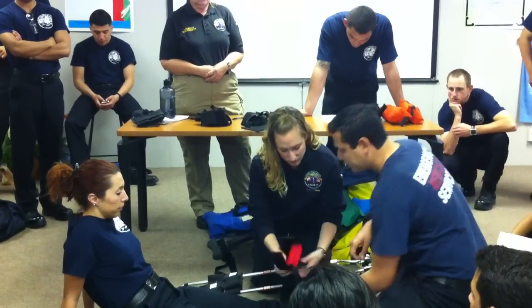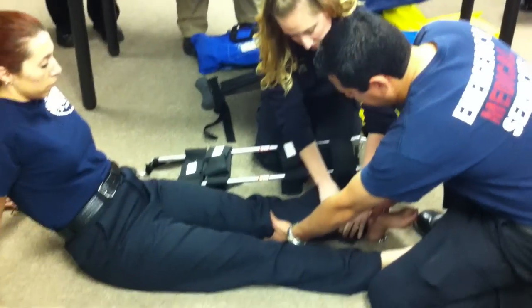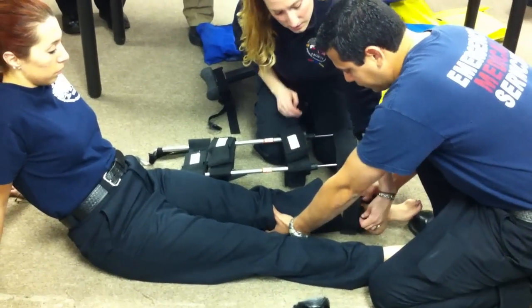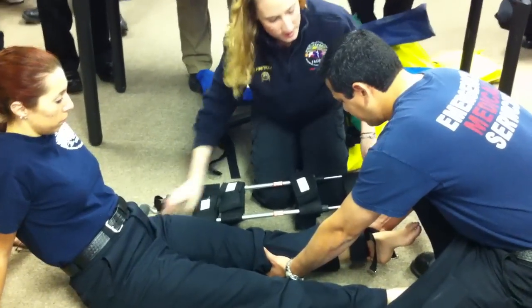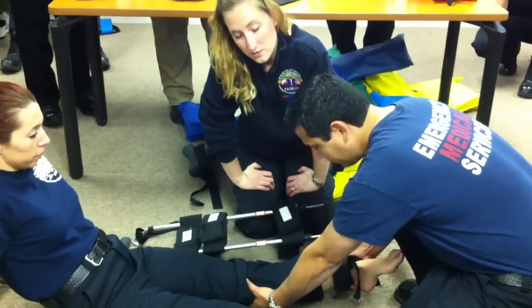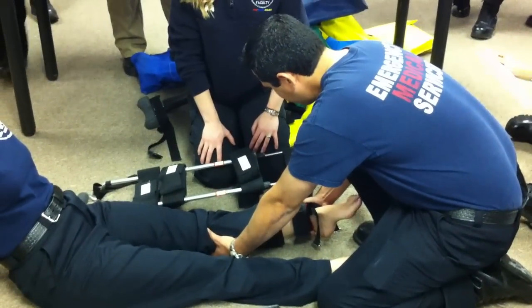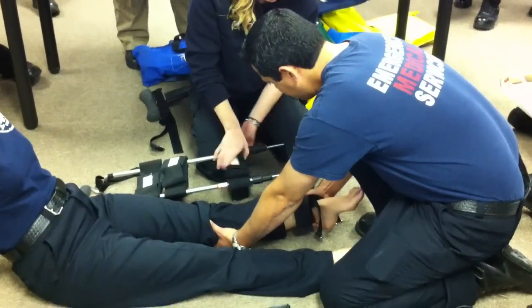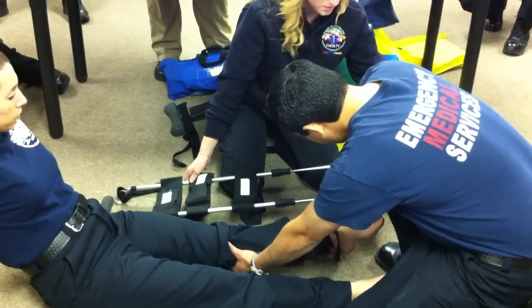Okay, so you're going to apply your ankle hitch. What's next? Measure the traction device against the uninjured leg. I measured right where I feel her pelvic bone meet her hip, that acetabulum area, and I measured the bottom. What's it say for the measurement? 6 to 12 inches beyond the foot. It measures from the ischial tuberosity at the pelvis to 6 to 12 inches beyond the foot. Okay, so we will make this longer. That's about 6 to 12 from the end.